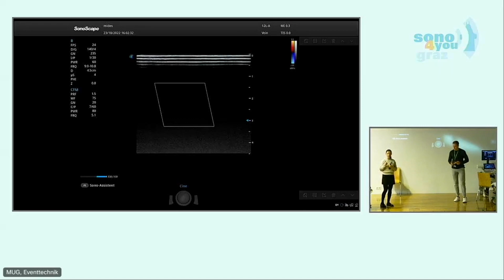We really need to be precise because we need to say there is a thrombosed vein. I'm not sure whether the patient had thrombosis in the history, for instance 2 years ago, and we cannot say whether this is a new one or an old one.